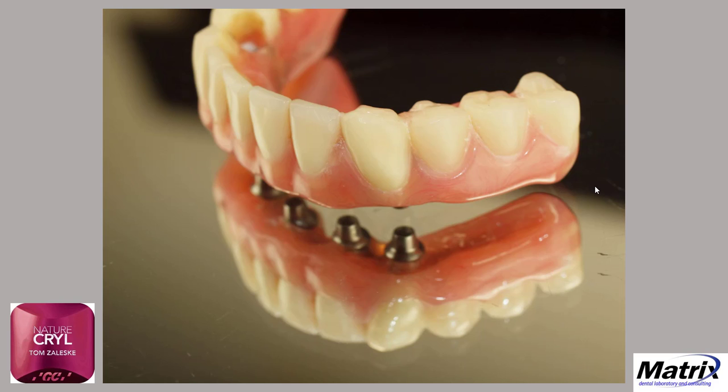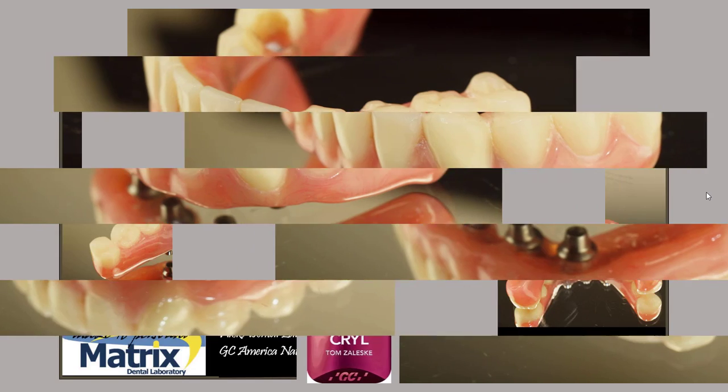Well, this case, if I'm not mistaken, is 5 years old, and I haven't seen it yet. 4 years old. I haven't seen it yet. So far so good. Fingers are crossed. But if it comes back, I have not warrantied it, so it will be another fee unless we go to facilitate a brand new bar.